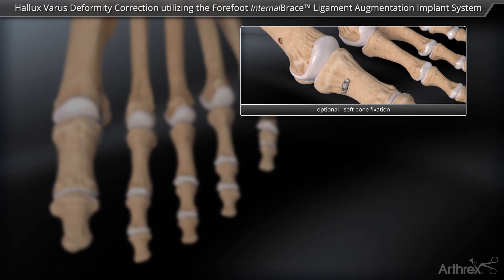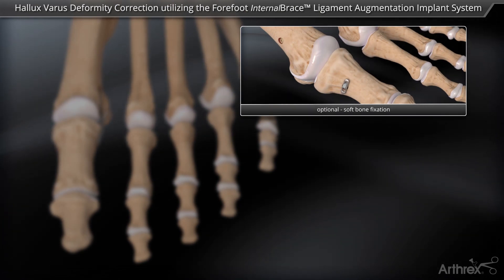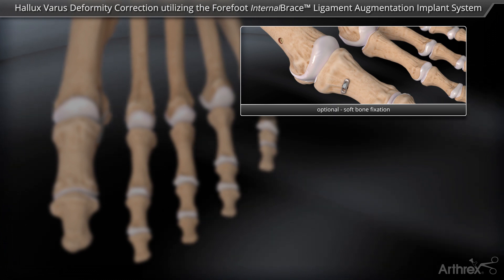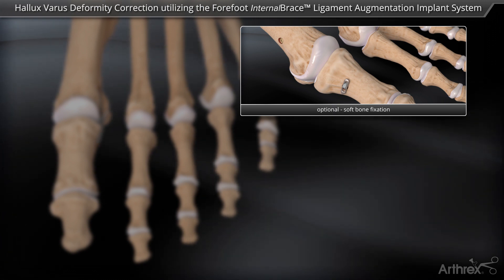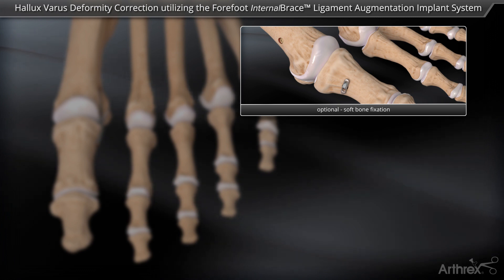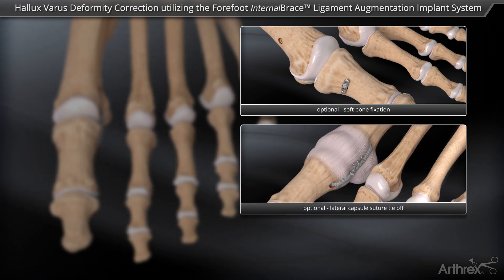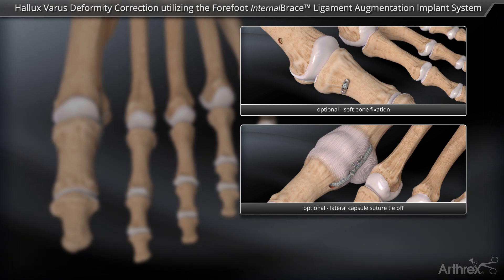In situations where the bone in the proximal phalanx is deemed to be too soft, a cortical button may be used with a looped fiber tape. In this case, two strands of fiber tape are passed through the proximal phalanx and the metatarsal head. Additionally, the lateral capsule may be reefed using zero fiber wire suture to further enhance the repair.